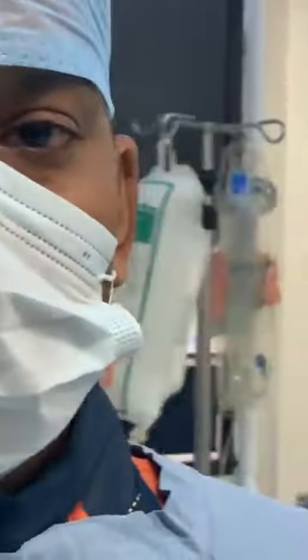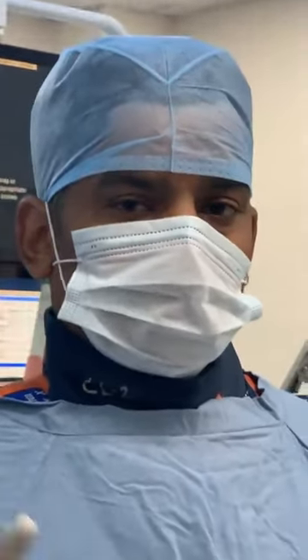So this is how we do it. Now we have done a carotid artery stenting with the distal embolic protection. We have looked at the cerebral circulation, which looks perfectly all right. Now we will remove the Navi 6 and look at the cerebral circulation. If everything looks okay, wait for about 5 to 10 minutes and then the final angiogram will come out.